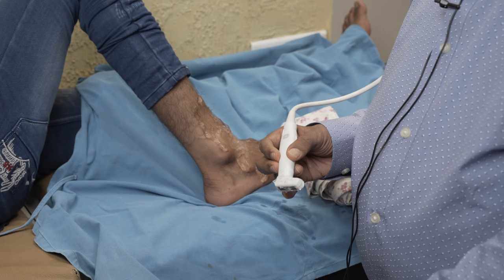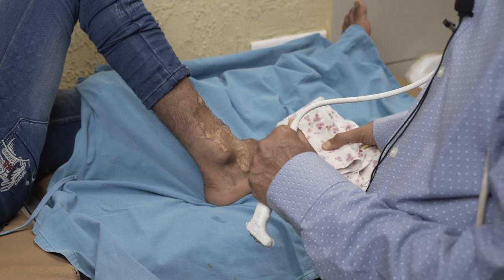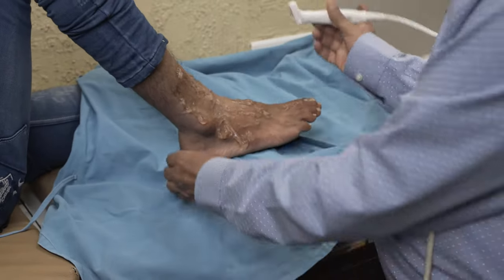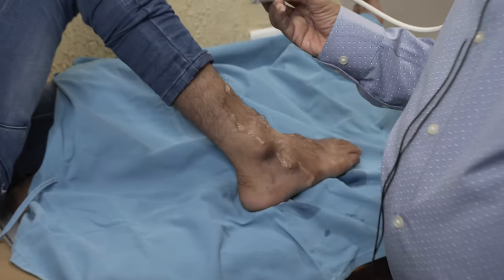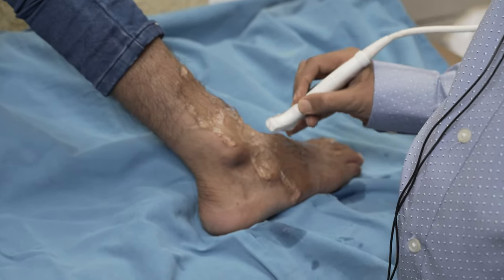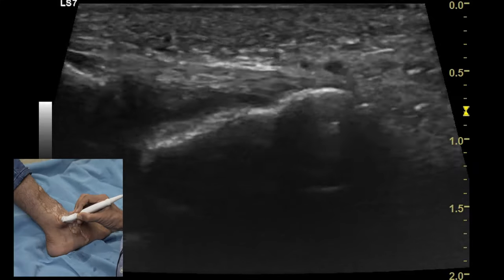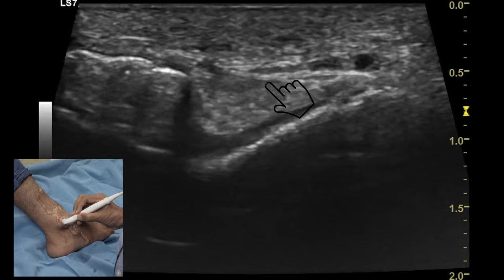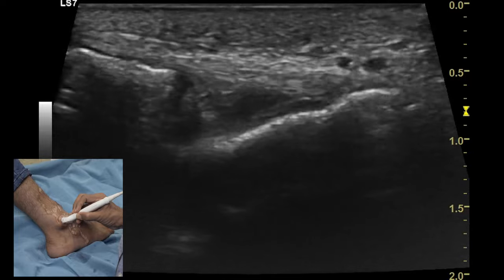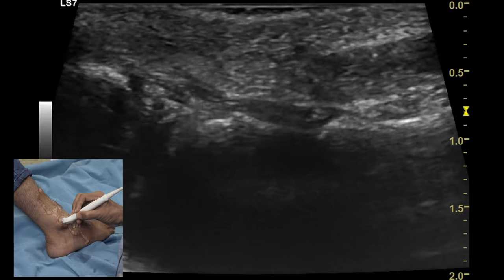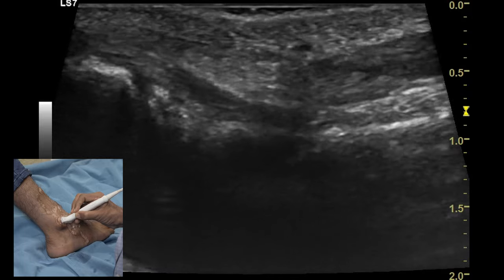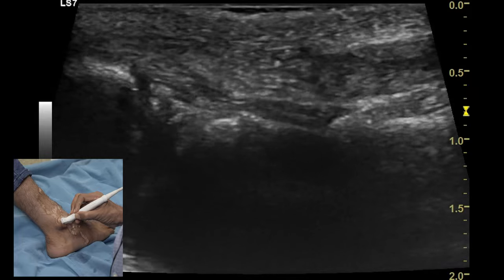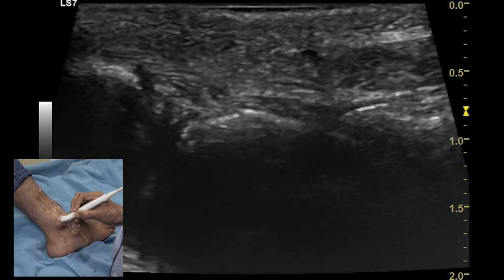In order to evaluate the lateral ligamentous complex, one needs to keep a small bolster under the medial aspect of the ankle, allowing better skin surface contact, and the patient is asked to move the ankle into a little inward position. By connecting the lateral malleolus and the talus, one can easily appreciate the compact echogenic pattern of the anterior talofibular ligament, which can be visualized from medial to lateral aspect by rocking the transducer. While examining this ligament, one can also look at the cartilage covering the talar dome as well as the fat in the lateral gutter of the ankle. In patients with lateral impingement syndrome, this structure may show presence of thick synovitis.